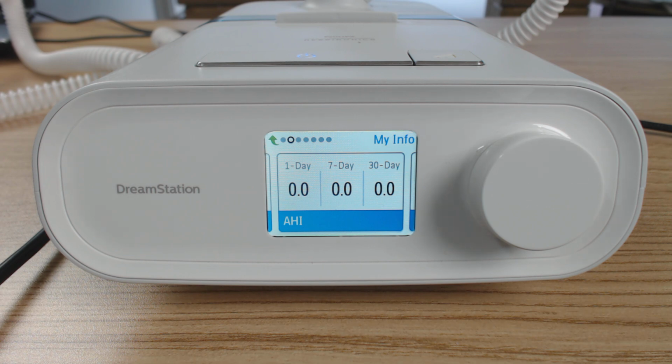If you're between 5 and 15, you're still actually having mild sleep apnea. 15 to 30 is moderate, and over 30 is severe. So you want to try and get that down to less than 5. If you're just a bit over 5, not a big deal, but certainly if you're getting towards 10, you might need to consult your sleep care professional in regards to trying to get that number down.